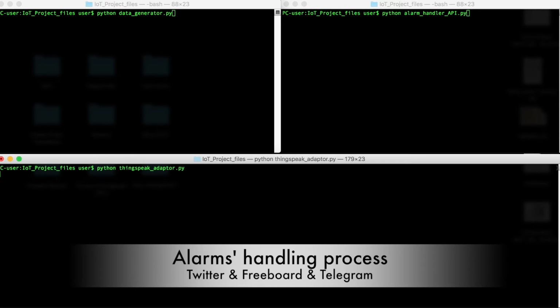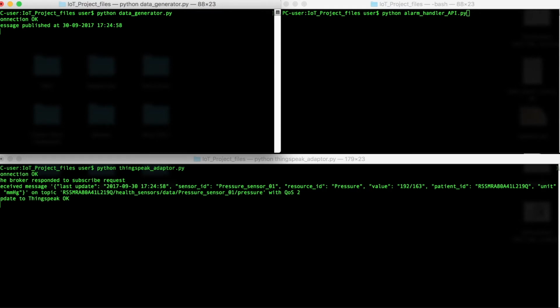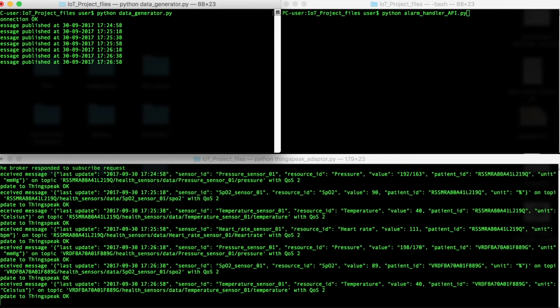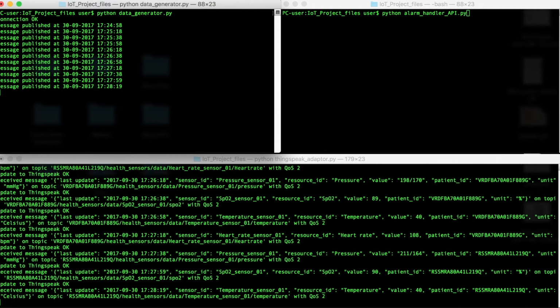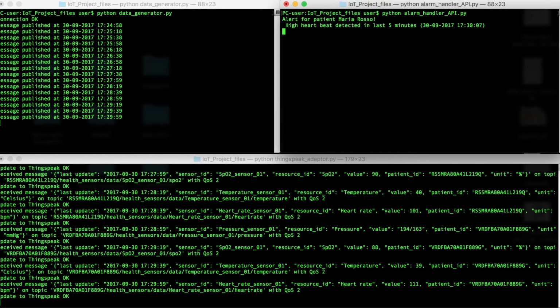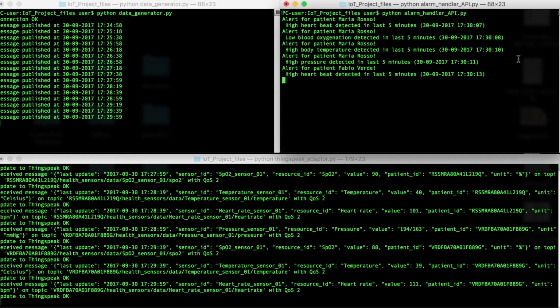Now, we set the data generator to send non-physiological values in order to test the alarm handler service. These data will be uploaded on ThingSpeak platform, as we can see from the screen. For this demonstration, the time window for processing patient data is set to 5 minutes. When an alarm is generated, it is automatically sent to the Twitter channel and to allowed Telegram users.